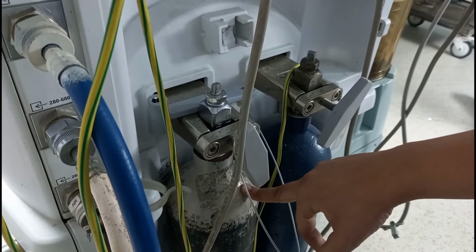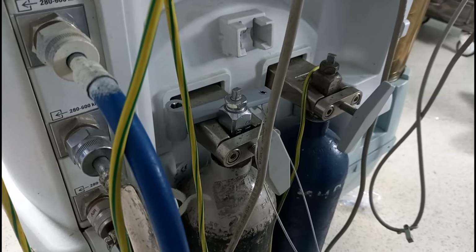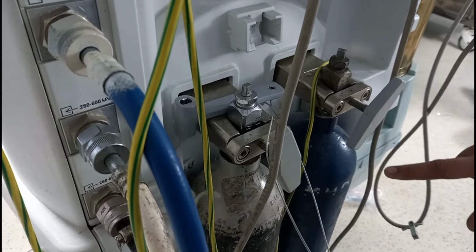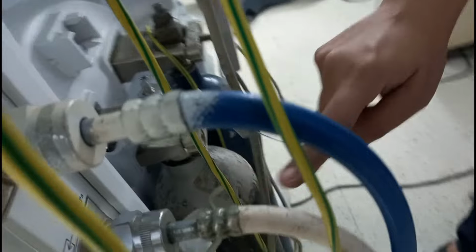This is a part of high pressure system, but the cylinder pressure regulators and the gauges which we could see in the Boyle's apparatus are not visible in this machine. Again, these are the pipelines which are coming, which were not in that machine. These pipelines, as I told you, are color coded. These are color coded for nitrous, air and oxygen.